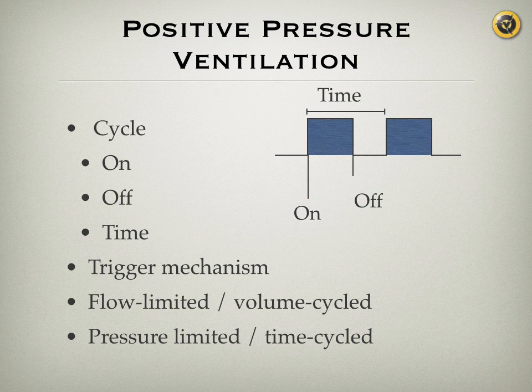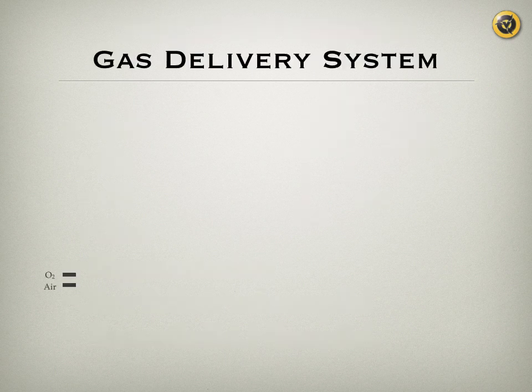Let's look at the anatomy of any ICU ventilator. Any ICU ventilator will start with an oxygen source and pressurized medical air usually. You blend those together with a blender, and that blender sometimes is outside the ventilator or inside the ventilator. And you take that mixture according to your FiO2 that you want, 50% say, and you put it through a valving system.